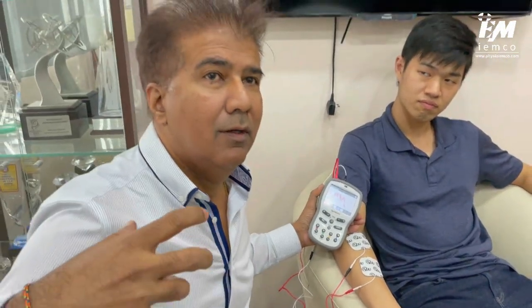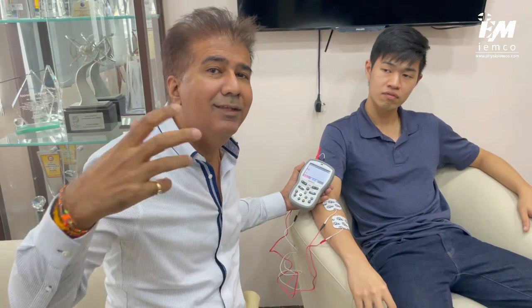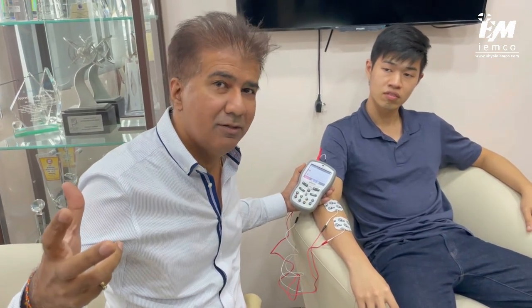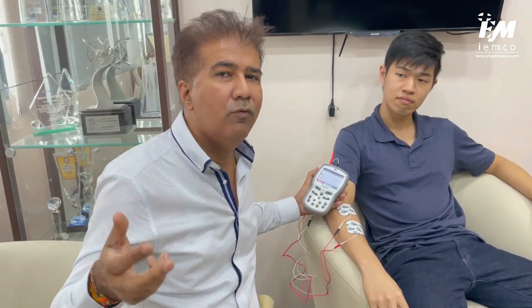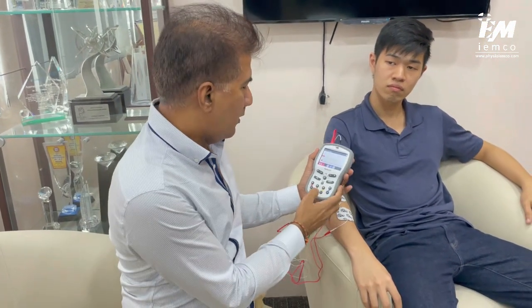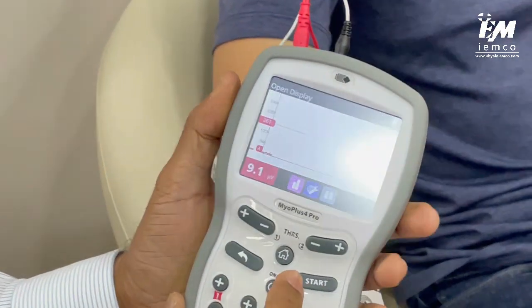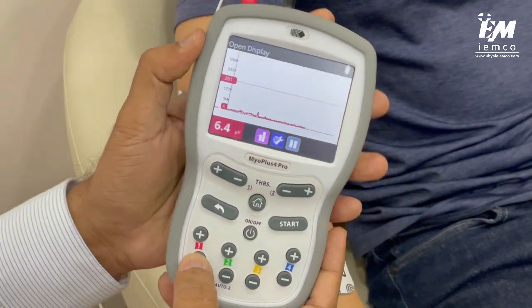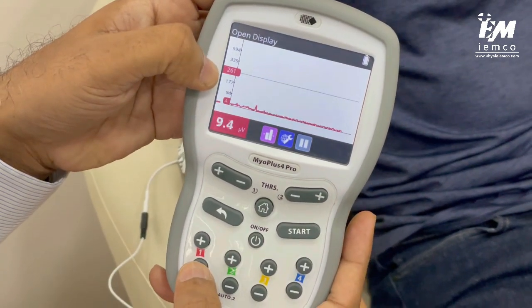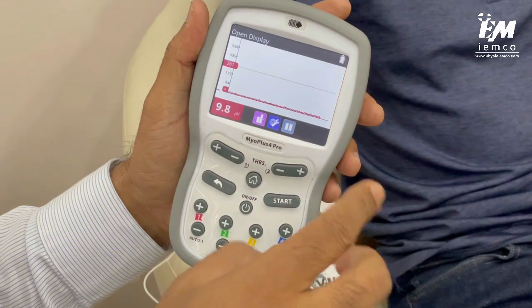Compare what he did with the slow movement — below 100 microvolts — versus the strong attempt, which produced three times more action potential generation. That is the quality of movement we want patients to perform when strengthening. Now, we can also set a target for JJ to perform. I'll press this button — the red number shown, 261, reflects the target line that he should be reaching.